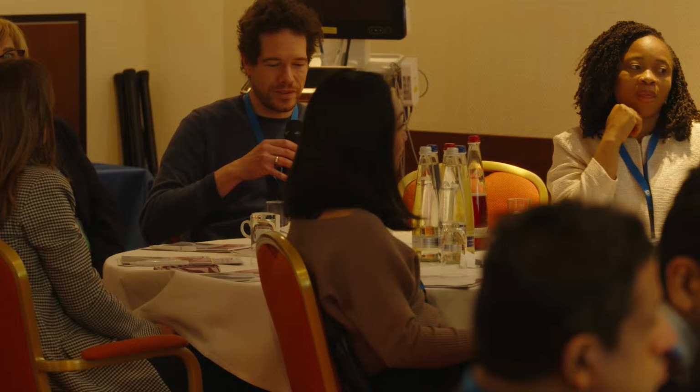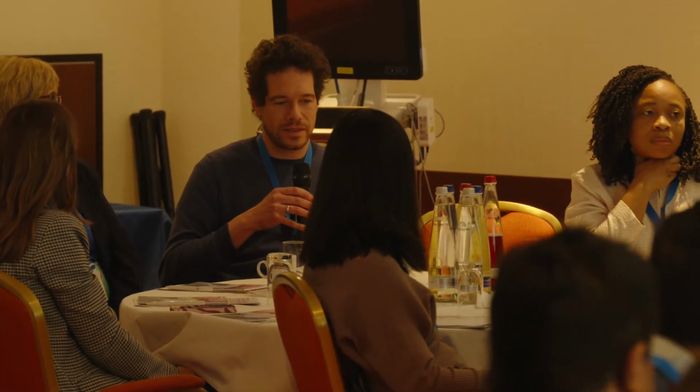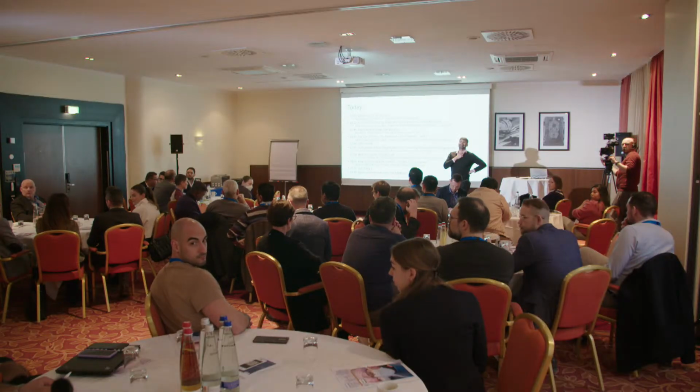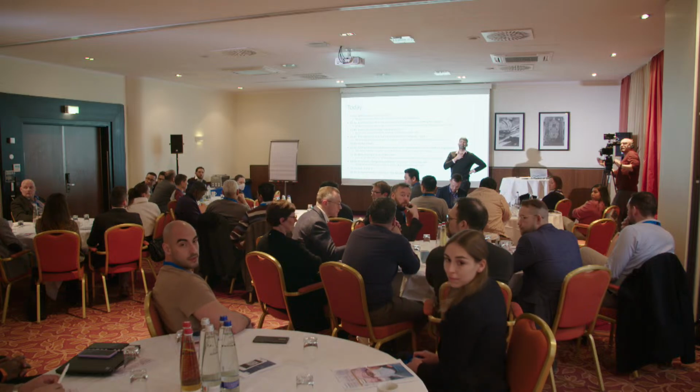Yeah, hello, my name is Stefan. I'm a vascular surgeon, and we use IVUS quite a lot, but mainly for the central veins, quite rarely in peripheral arteries so far. My name is Frans. I'm from Västerås General Hospital, Sweden. We use IVUS mostly for venous cases, but sometimes for peripheral arteries. So not a lot of peripheral artery experience.